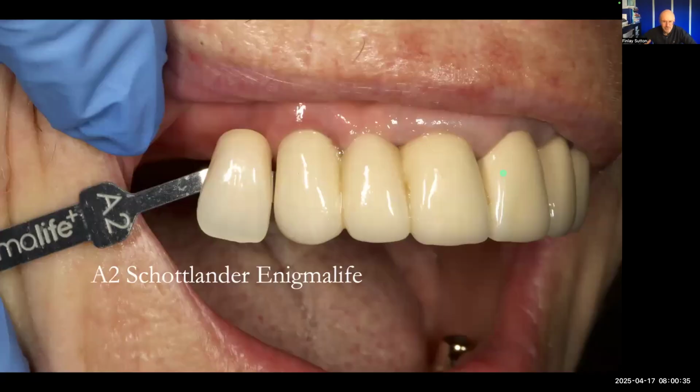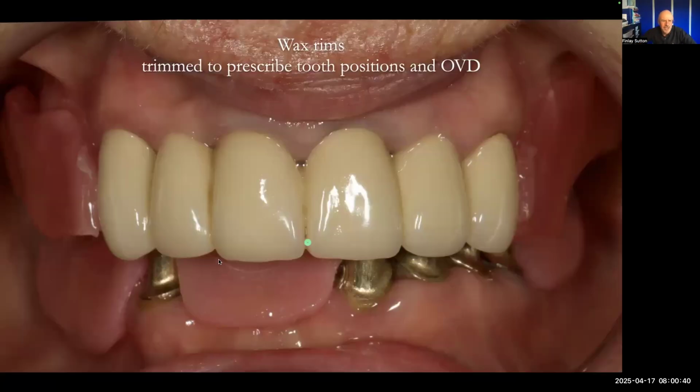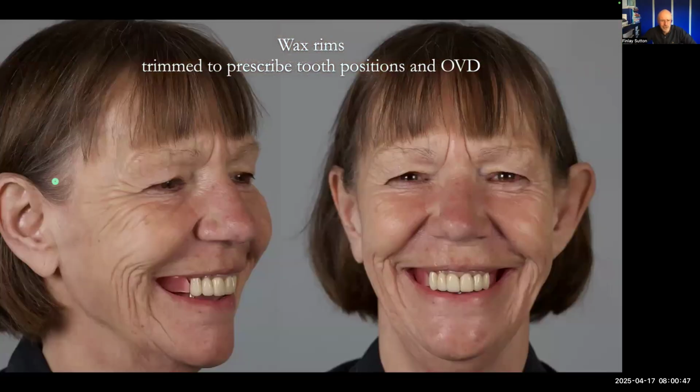We took the shade here, which is A2 for the teeth, and then I trimmed up the rims upper and lower to get the right vertical and also to get the right buccal corridor. So we've got this in place. I take some photographs just to make sure, and this goes through to Rowan so he can then set the teeth up and also make any corrections if he feels I've over trimmed it, maybe in that area, so he wants to just bring the smile out a little bit there. He can do that when he sets the teeth up. So I do think these photos are just wonderful for that purpose.